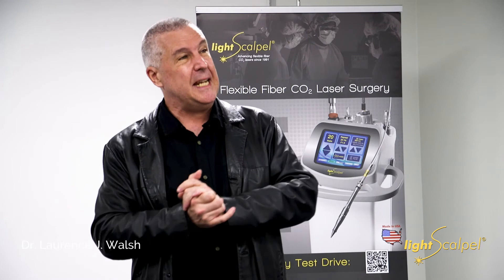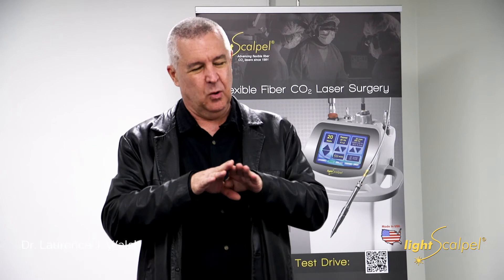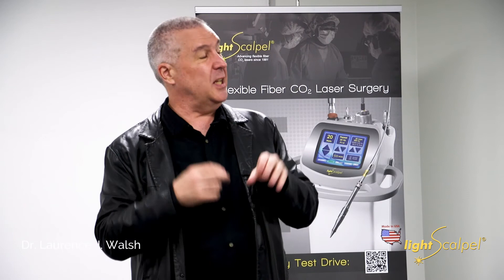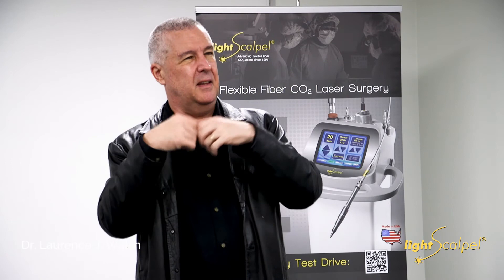Question: Can you comment on suturing? Only when I use the CO2 to raise an incision — and you may have noticed the incisions on the videos are all self-opening incisions that actually peel open. I've done a fair bit of flap surgery using the laser to cut the initial incision. However, at the end, before I suture the edges together, I'll always give those wound edges a little rub to ensure some small bleeding — because it's that blood which forms the biological seal at the wound margins. If you don't do that and the patient's a smoker who goes outside after surgery and starts smoking, you can actually get a post-surgical wound infection. It's happened to me once in 30 years, but I always make sure to oppose the edges and give them a little rub before putting in the mattress or interrupted sutures.